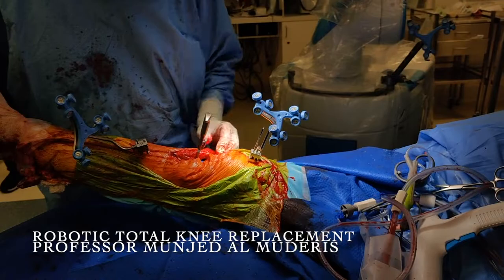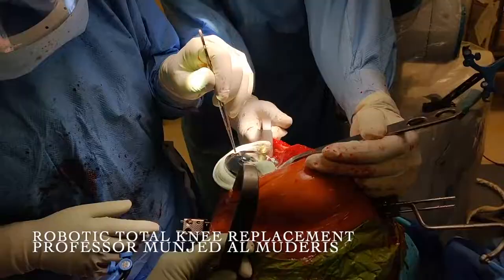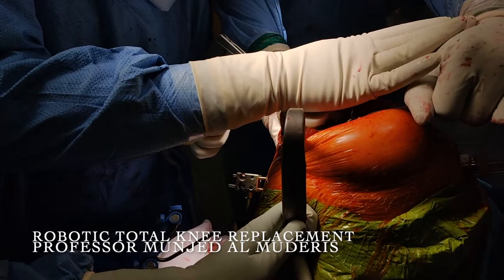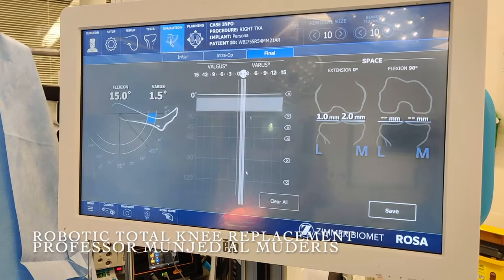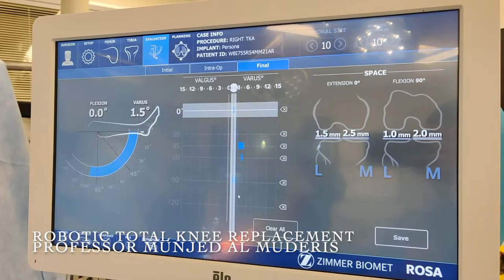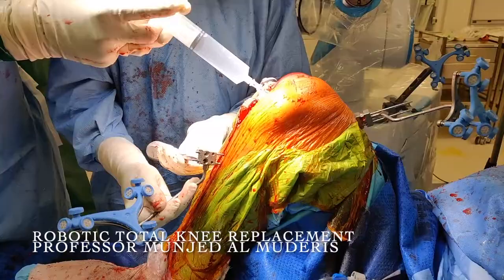We can proceed with the definitive implant. Despite there being no tourniquet, there is hardly any bleeding. We position the definitive tibial implant and carefully remove the excess cement. I insert the plastic component as planned by the robot, then insert the femoral component. I assess the implant position and tracking on the computer — the tracking is excellent. We achieved zero flexion deformity, one and a half degrees of varus in extension, and zero degrees at 100 degrees of flexion. I am satisfied with the patella tracking as well. We place the patella and proceed to inject local anesthetics and perform closure.